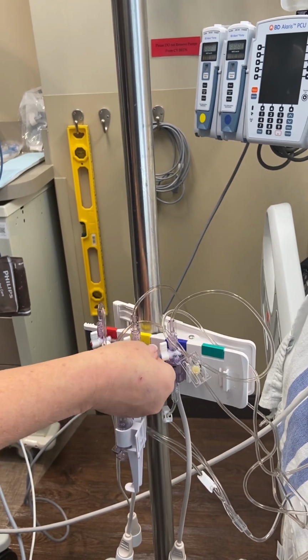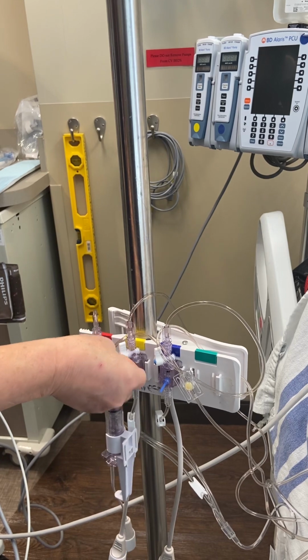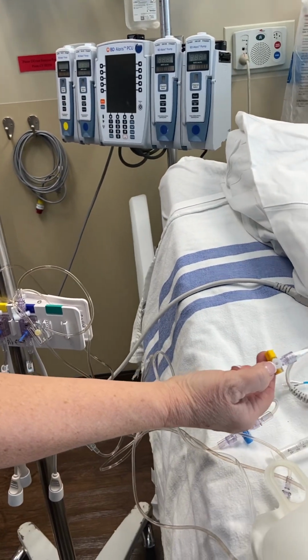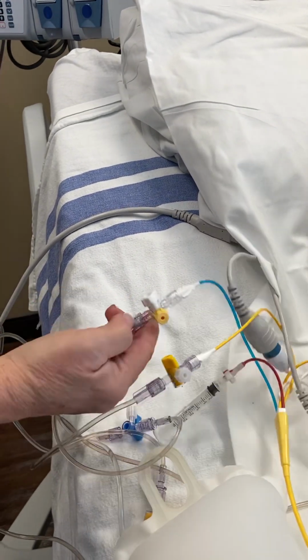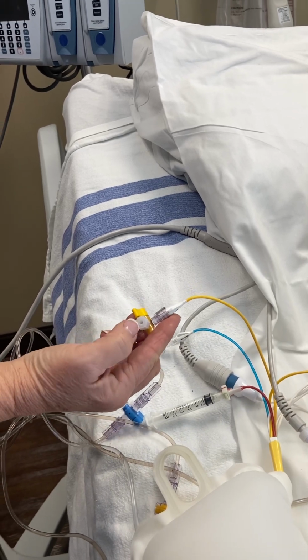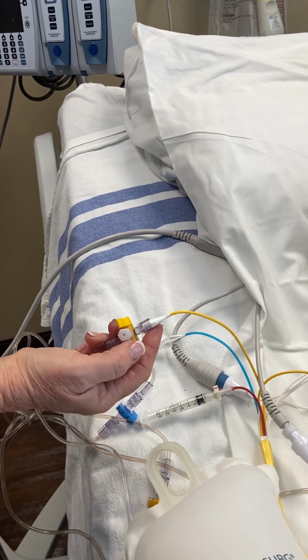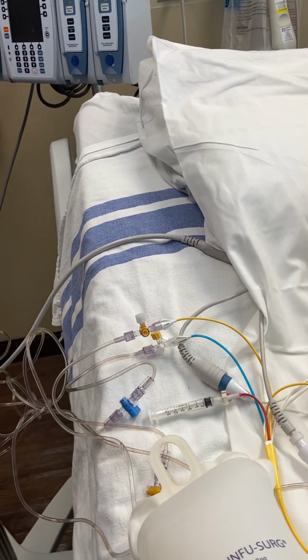I will say, let me just remind everyone too, so when the patient comes up, sometimes anesthesia gets busy and they forget to replace these little clear caps. So always remember that you replace them with these yellow dead ender caps, because these have a hole in them, and the patient could actually even get air through that if it was not cut off to them. So just make sure, as a safety thing, that's part of your safety check when you're hooking everything up.